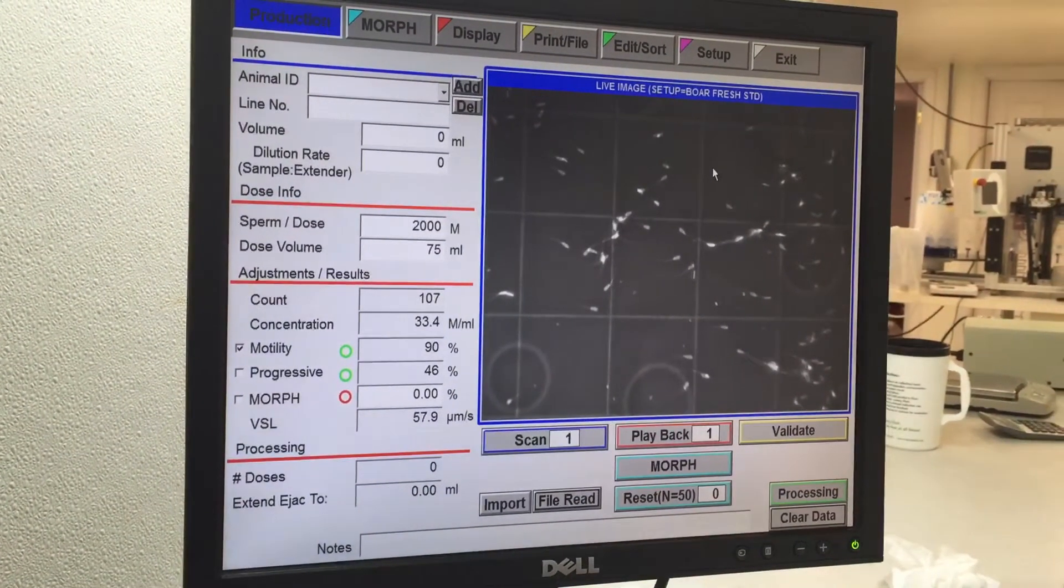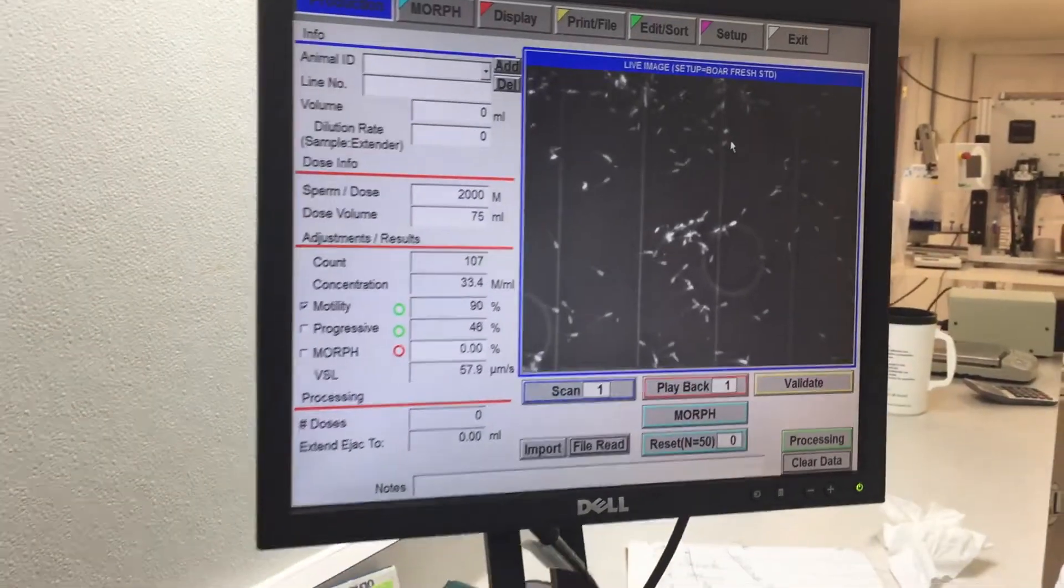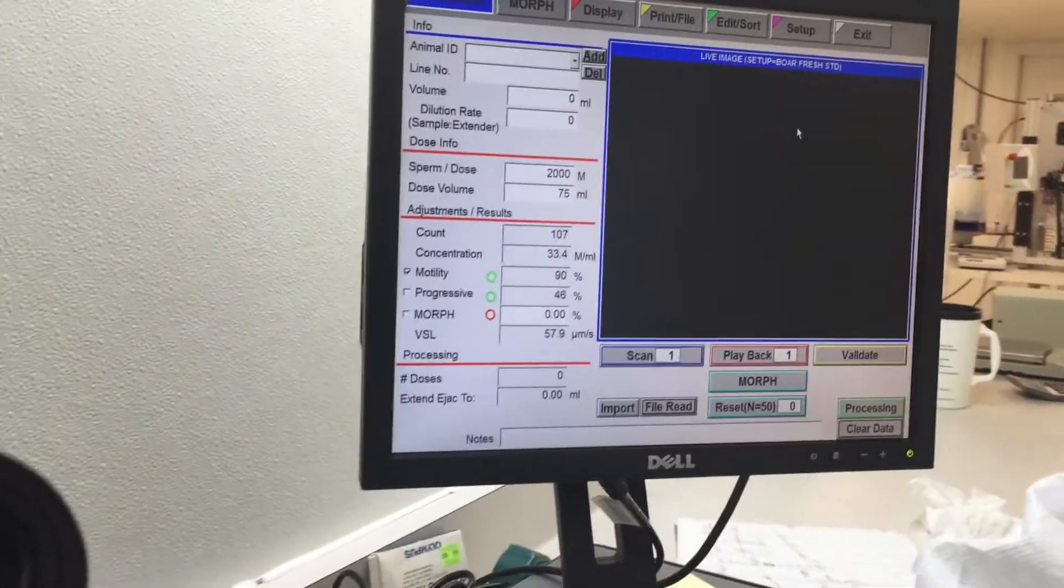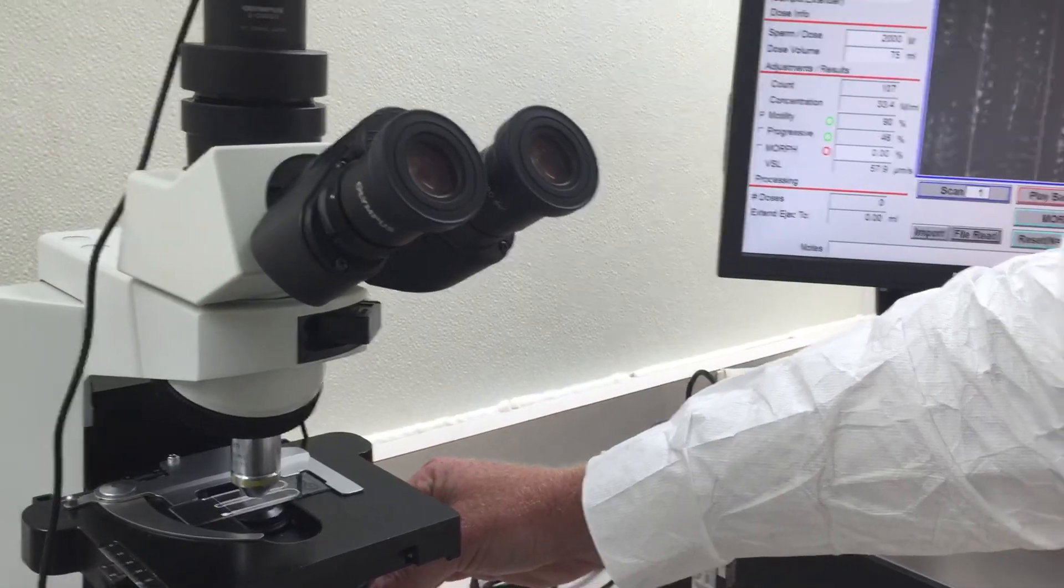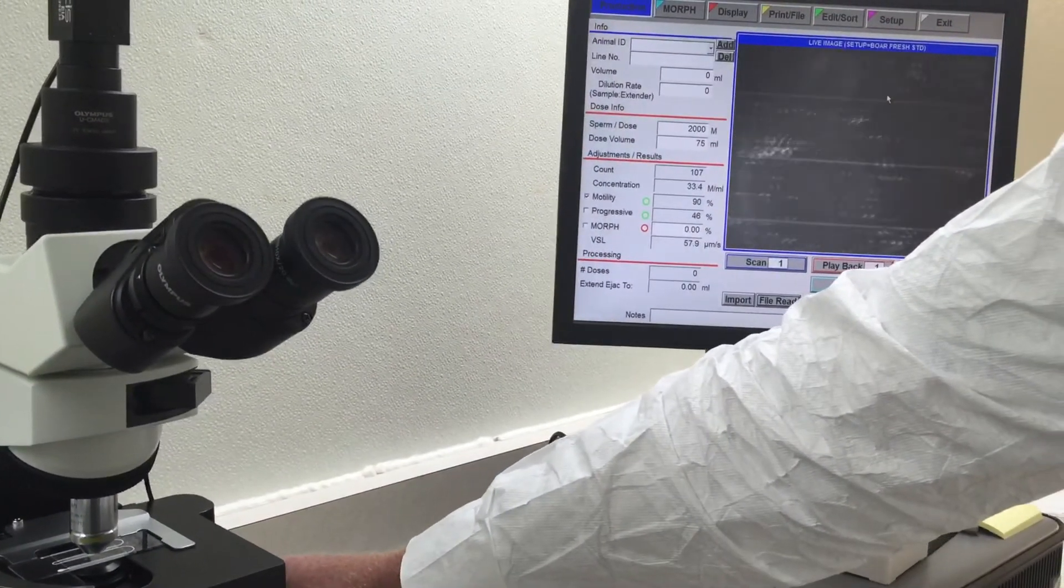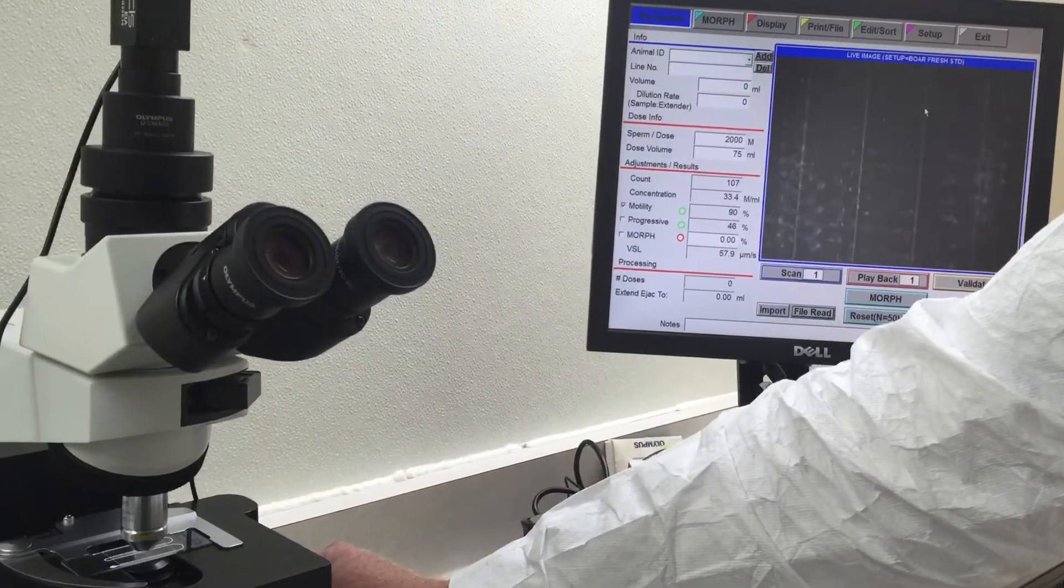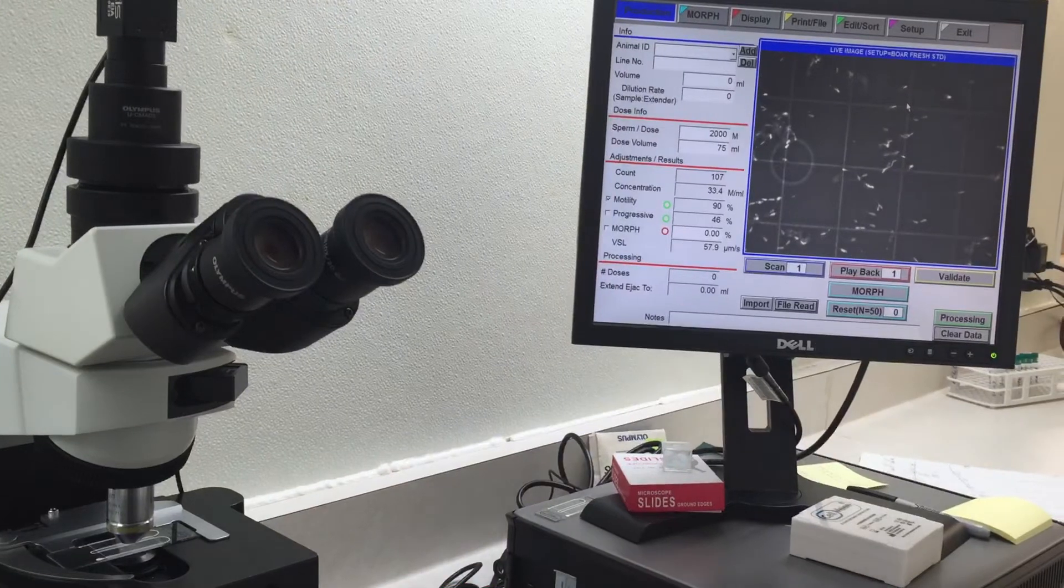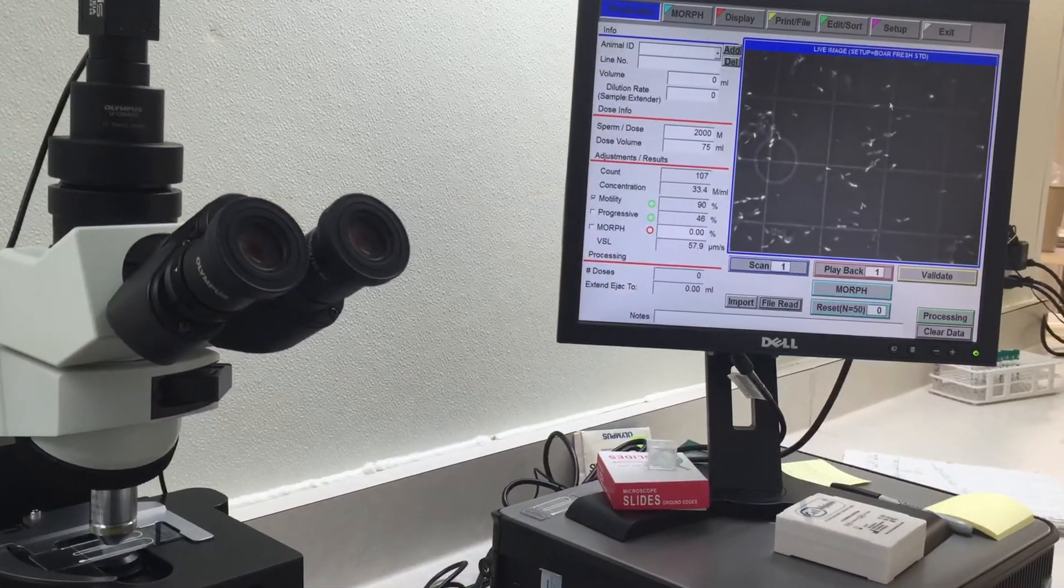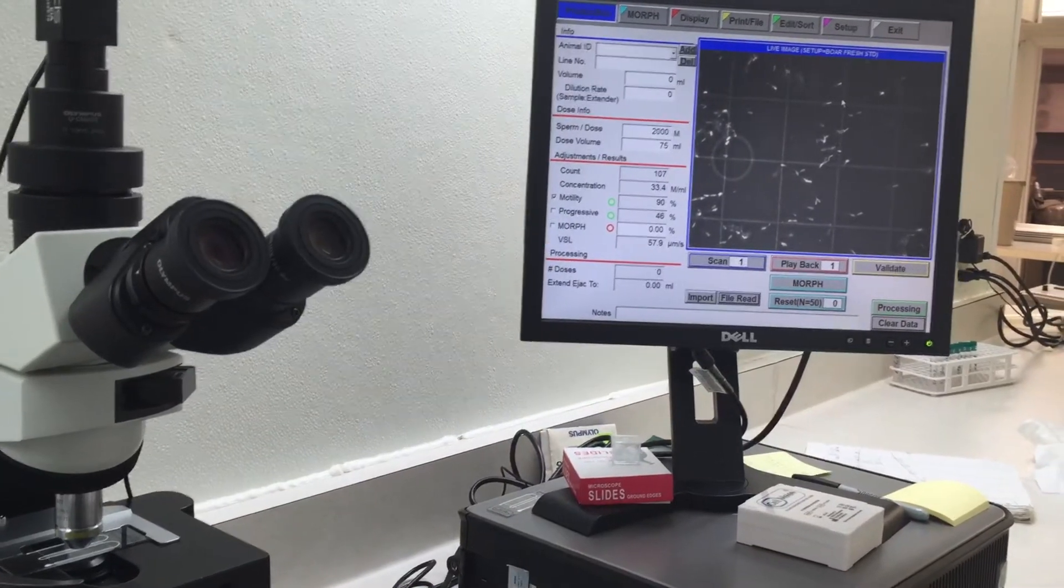So in that row of ten, we have forty-two cells. To do this accurately, we would do another count in this chamber, then move to the other chamber on the same slide and select two more rows to count. We would average the four. For purposes of this video, I'm just going to count those forty-two.